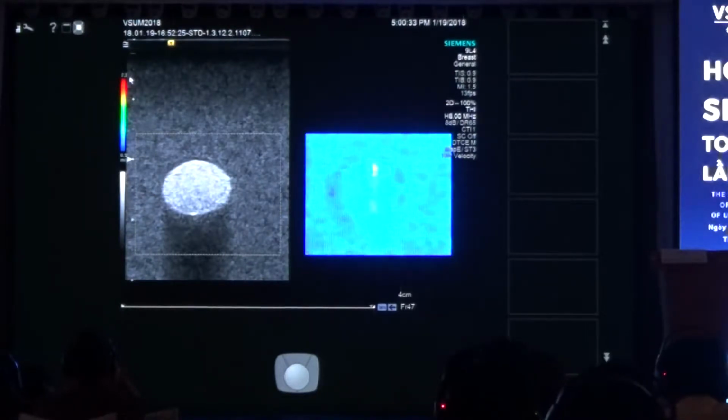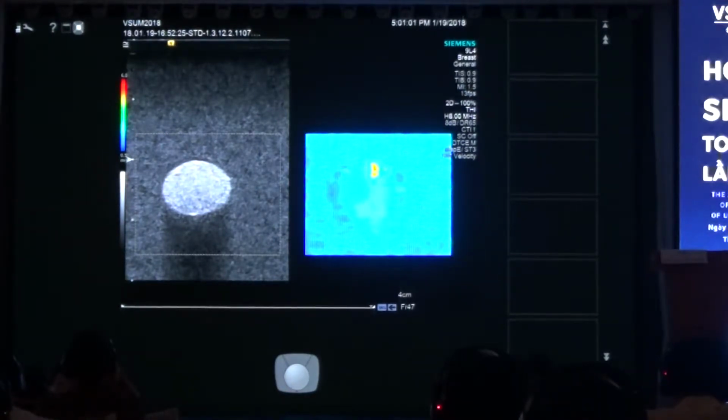So again, the default is 6 or 7, but it depends on which probe, etc. But if you did your measurement and it said high, then you could go ahead and change the maximum velocity to get it to be within the scale. The other thing is, again, this is the velocity map. I'm going to increase the value to make it look a little bit different colors.